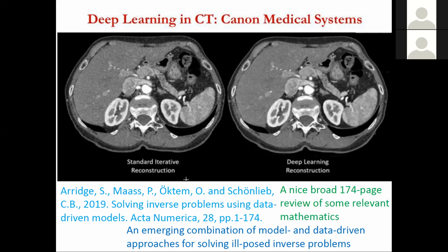Okay. So basically, you have the same acquisition. You can take the data and truncate it. Imagine it came in list mode. You could do literally that. You can do the equivalent, where one way to do it is to just do another scan with a higher dose this time around. Another way to do it is to model what's going on a little bit. The basic idea is either there's a real high dose scan that you're matching it with, or you can simulate it in what's called data augmentation.